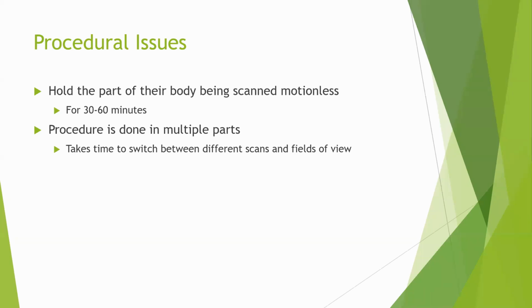So it is important to be motionless, because if the patient has lots of motion, especially in central nervous system disorder, if there are tremors, tics, or involuntary uncontrolled motion, they probably will not be able to do MRIs.